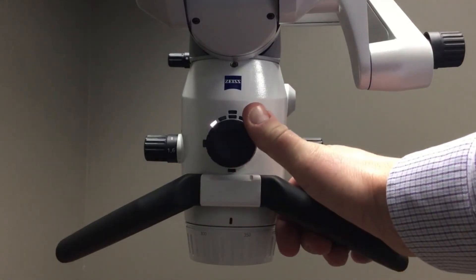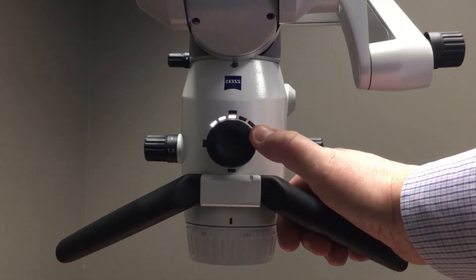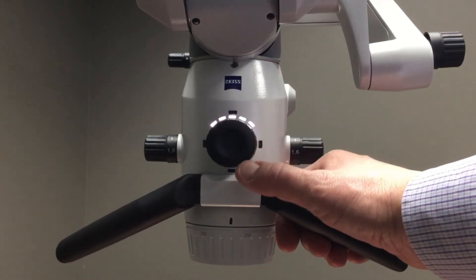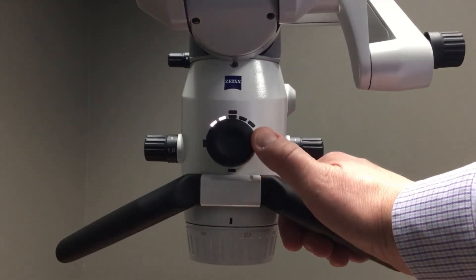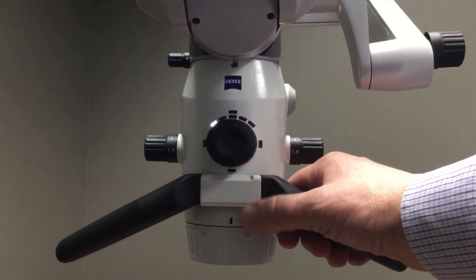I can then come up to the wheel, and by rotating the wheel you can see through the five LED illumination indicators that I am increasing and now decreasing the amount of light that the microscope is producing for my procedure.